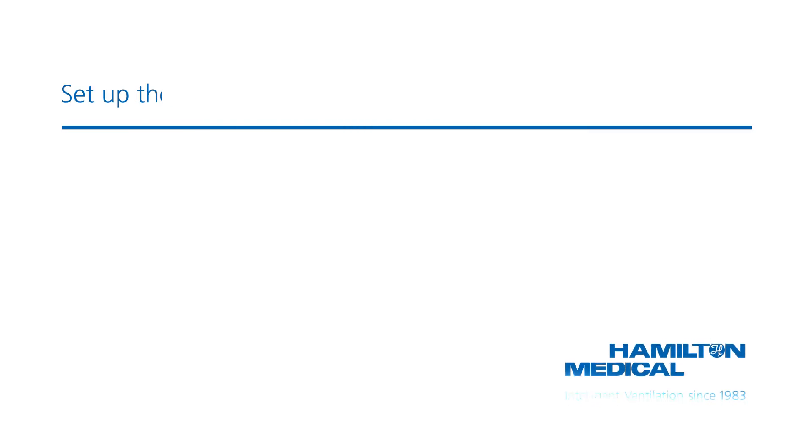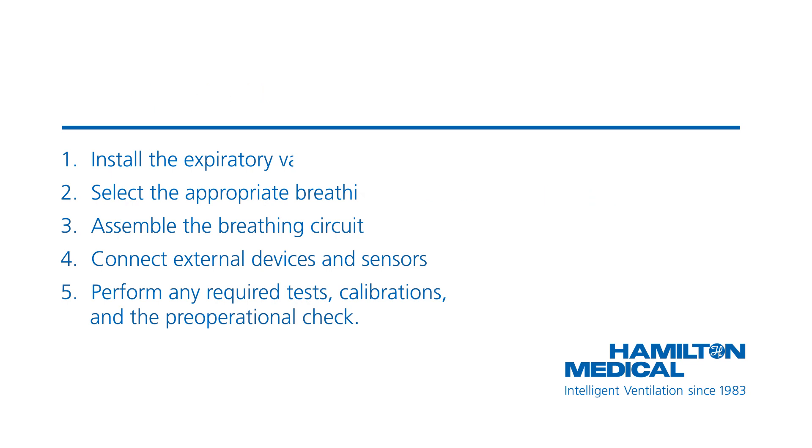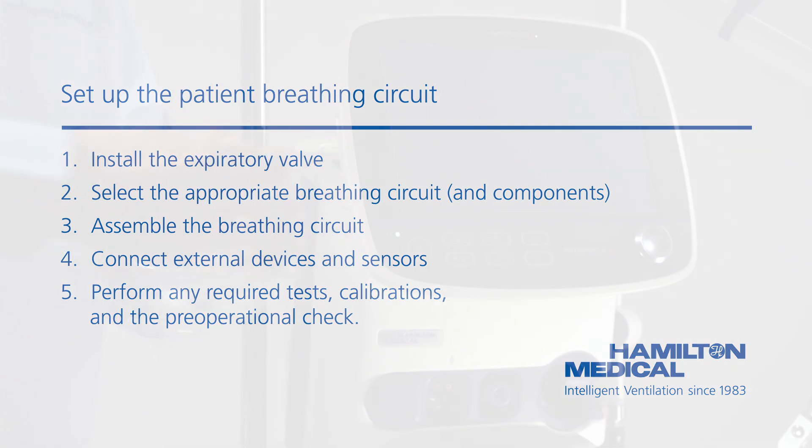To connect the breathing circuit, do the following. First, install the expiratory valve. Then, select the appropriate breathing circuit and components. Third, assemble the breathing circuit. Then, connect the external devices and sensors. Finally, perform the pre-operational checks.